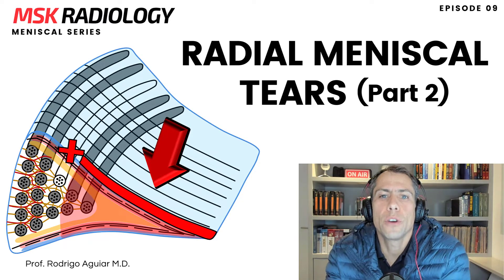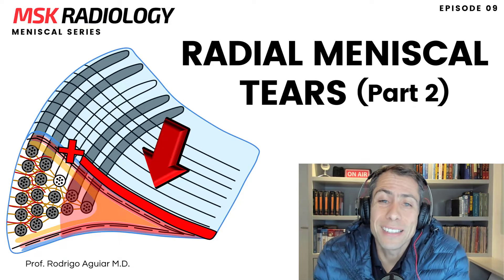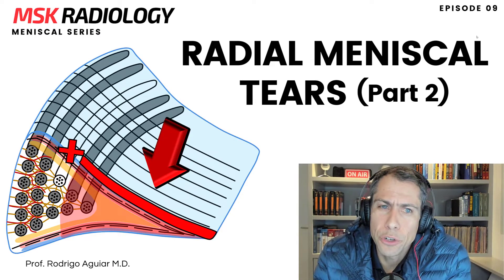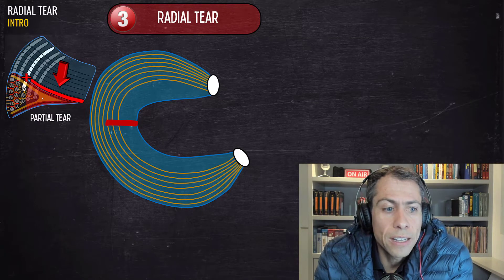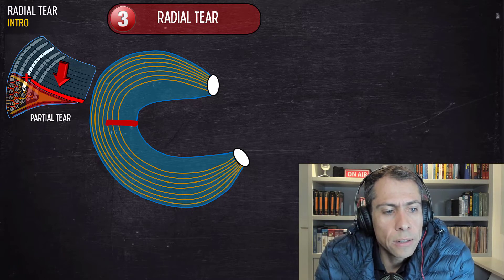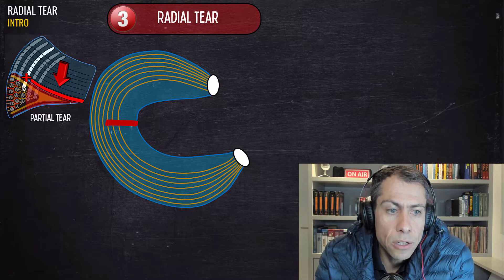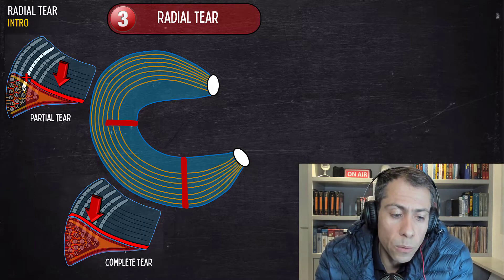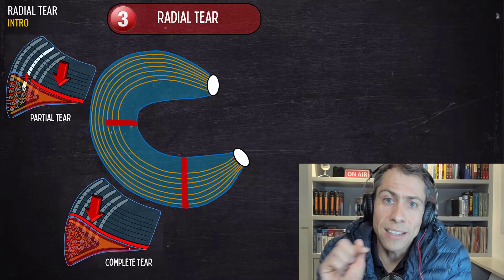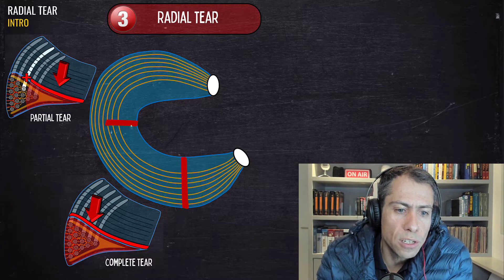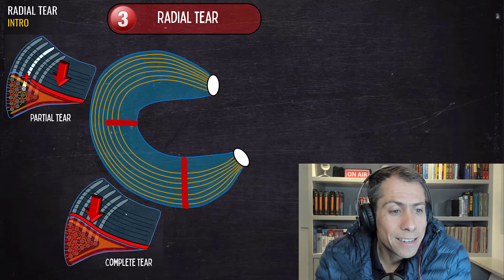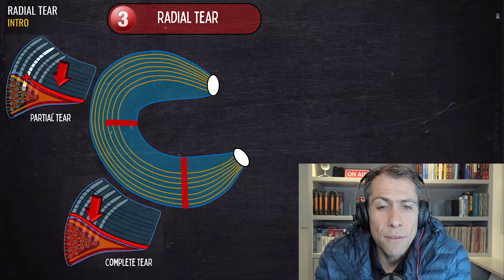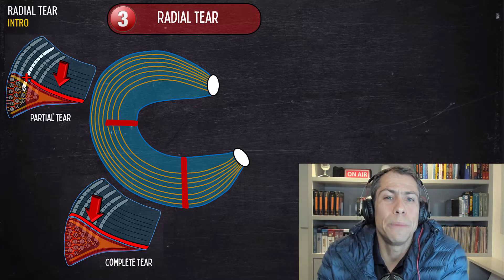Hi everybody. Today let's continue talking about radial meniscal tears and how we can see them on the MRI of the knee. A radial tear can be partial — when it does not compromise the full extension of the meniscus in the short axis — or complete, when it compromises the entire extension of the meniscus in the short axis. The partial tears tend to present a more benign behavior than complete tears.